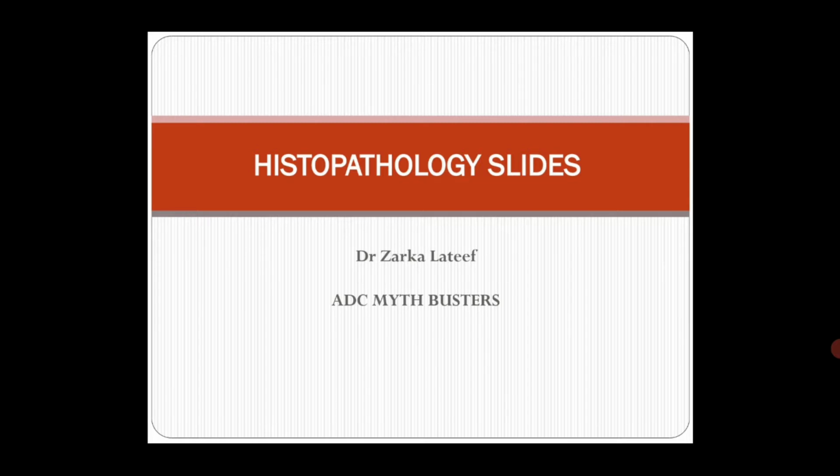I'll be discussing the histopathological slides that are asked in exams. Before going into details of how you need to identify a particular slide, we first need to know how a basic oral epithelium looks like under a microscope.